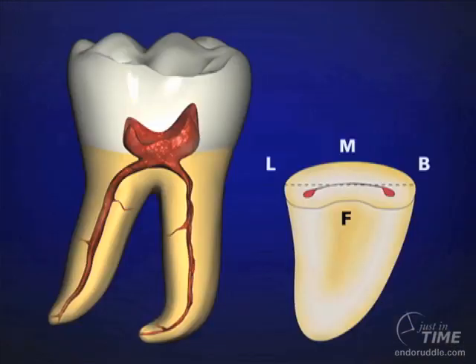Well, when we begin to look at this animation, if we do a cross-section through the mesial root, what you immediately notice as a colleague is that the canals at this level of coronal slice are not centered in the mesial distal dimensions of the root. In fact, the way the canals enter into the pulp chamber, it means the canals are a little bit off axis. They're not centered and they're skewed slightly towards the furcal side concavity. This means there is importance in relocating those orifices away from furcal danger and to end up with a final prep where the orifices are centered in the mesial distal dimensions of the root.